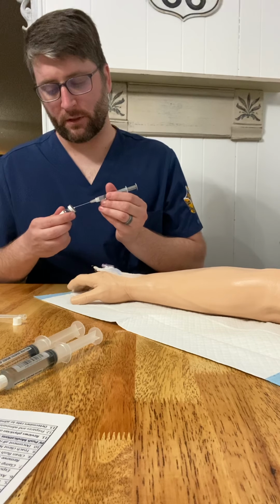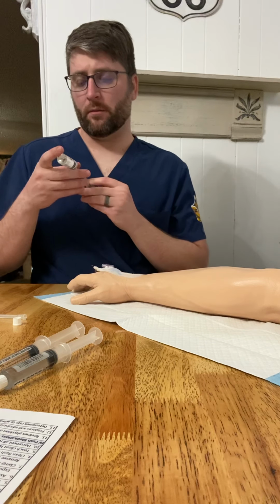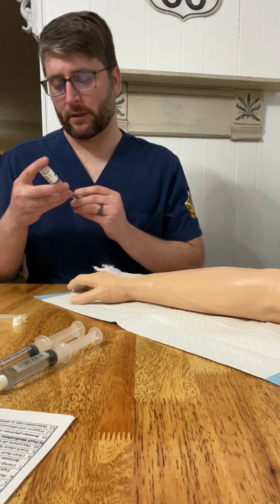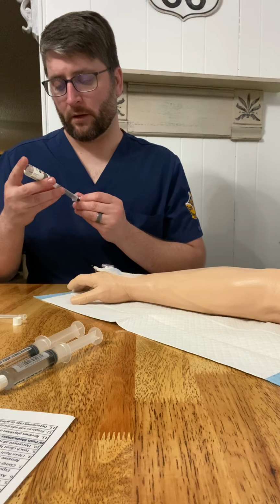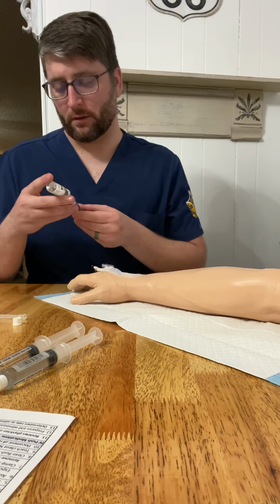I'm going to put this in here just like so, inject our air, and that was a brand new bottle, so it was disinfected to begin with, and then just for extra, we did disinfect it again.